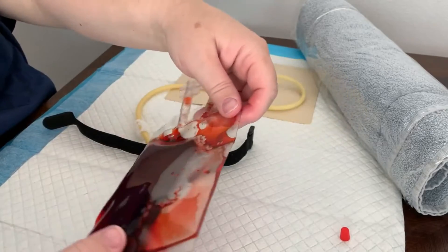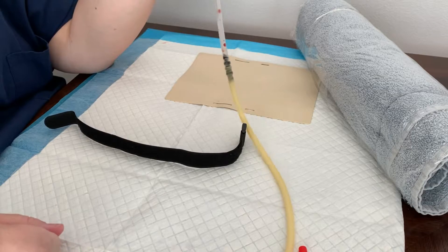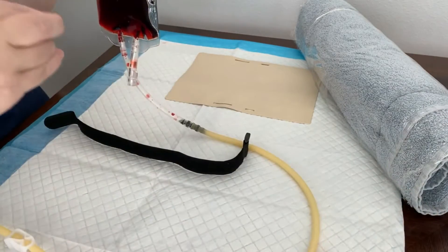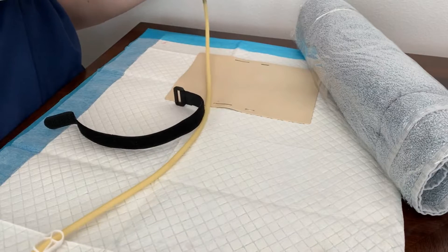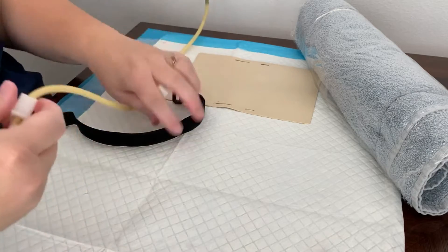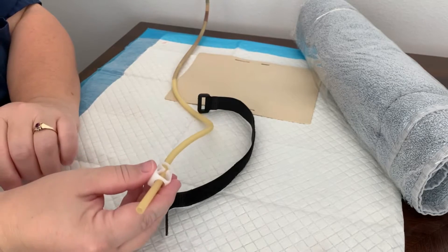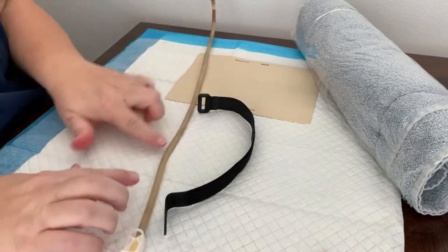Now we're ready to prime our tubing. When you turn the blood bag over, it doesn't really do anything on its own — you're going to want to have it up out of the way, because gravity is what's going to put enough pressure to make a flash when you start your IV. I usually put a push pin in it and attach it to the wall, usually higher than this. Once you've got it up, go ahead and unclamp the tubing and let the fluid flow through it until it gets close to the end, then clamp it so it doesn't leak out. Now we've got blood in our tubing.